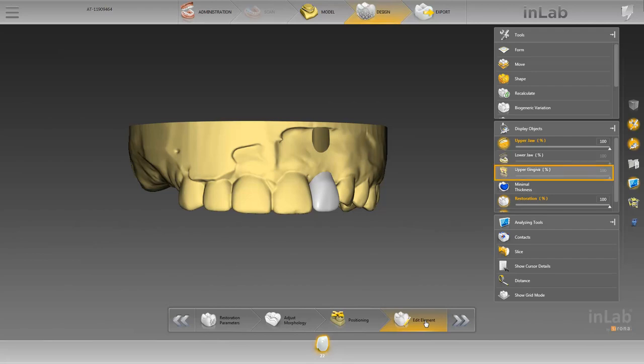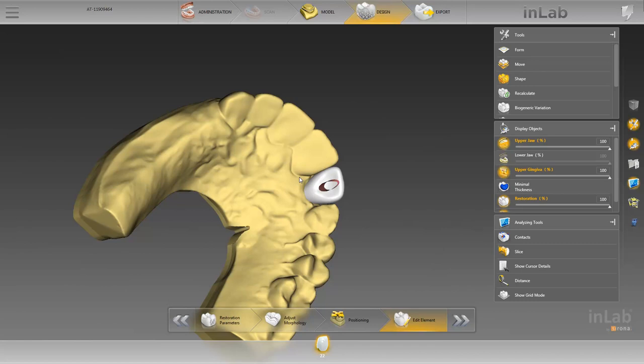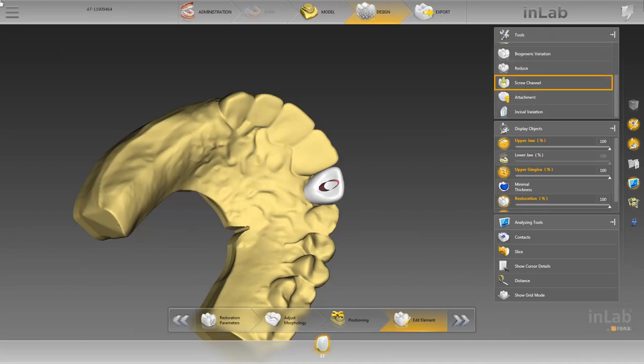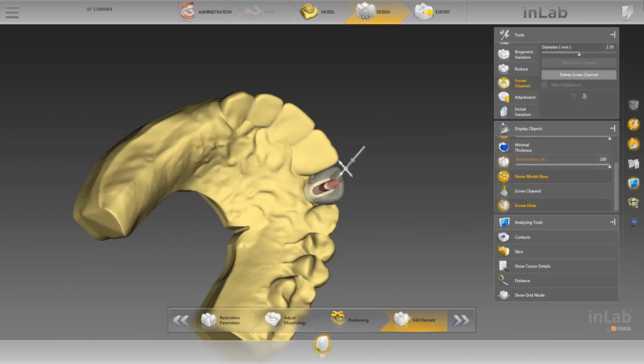Therefore, we activate the function upper gingiva in the window under display objects. The position of the Atlantis abutment screw channel, displayed in red, can be seen very well from palatinal. To plan the opening for the screw channel in our restoration, we activate the tool called screw channel and then click add screw channel. Now our restoration is transparent and with the help of the displayed arrows, we can adjust the tilt and position of the screw channel so that it matches the position of the Atlantis core file screw channel.